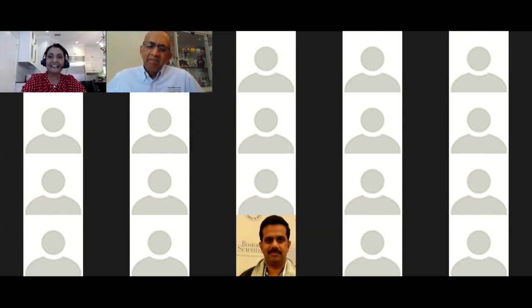Good morning. Thank you, Dr. Raju, for the presentation. I did learn extra things as well for my knowledge and what I can do better for my areas in the scope room. As far as anything, we try to stay within the 1 hour window. With COVID, everything has been a lot simpler for us to make sure we get the pre-cleaning done in the room, the manual cleaning within the hour, and the scope in the reprocessing machine within the 1 hour. So that hasn't been a problem for us.